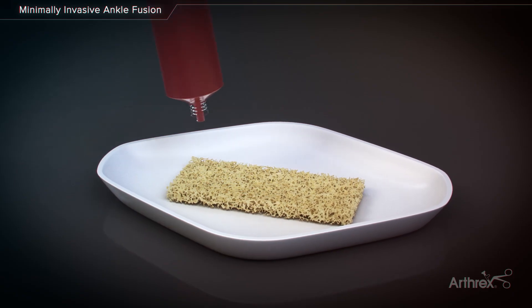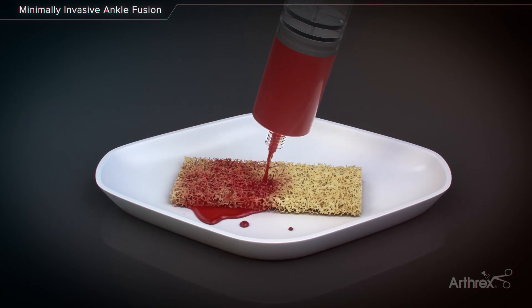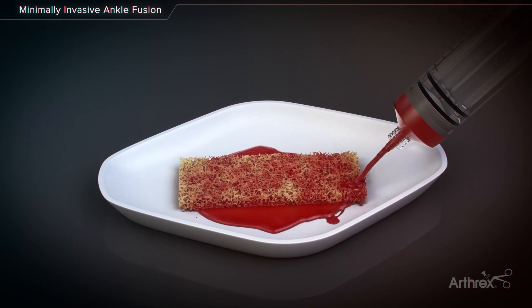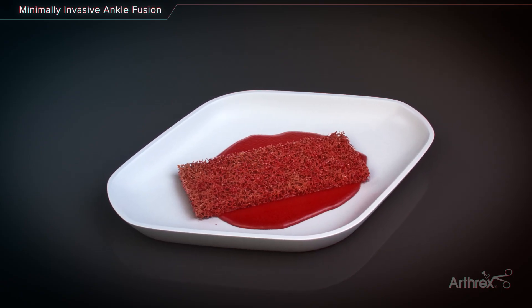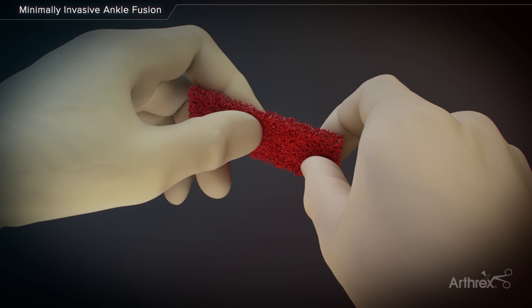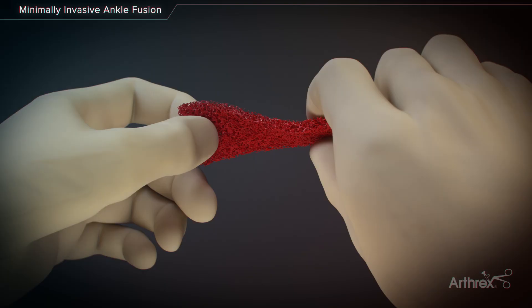Allosink demineralized cancellous sponge and cortical fibers can be hydrated with autologous fluid, such as platelet-rich plasma or bone marrow aspirate. During hydration, the graft will naturally wick up and retain the surrounding fluid, making it an ideal scaffold for cells and growth factors. After hydration, Allosink is flexible and easy to handle, which allows it to be inserted around different types of bone defects prior to fixation.